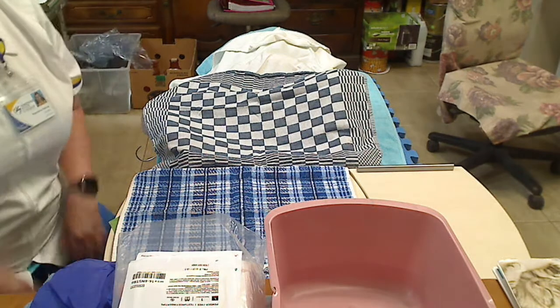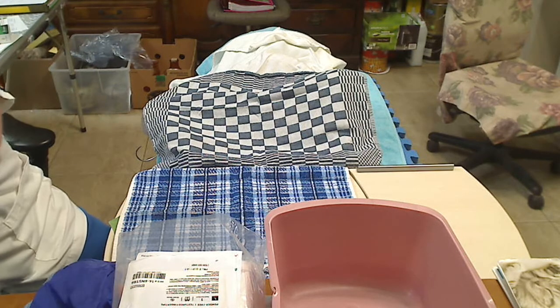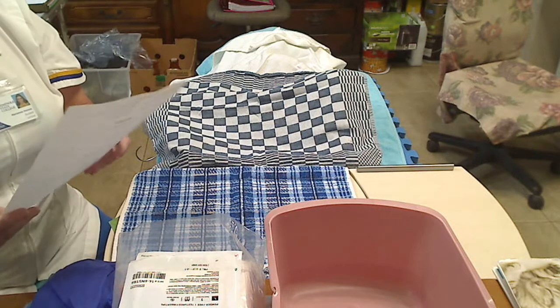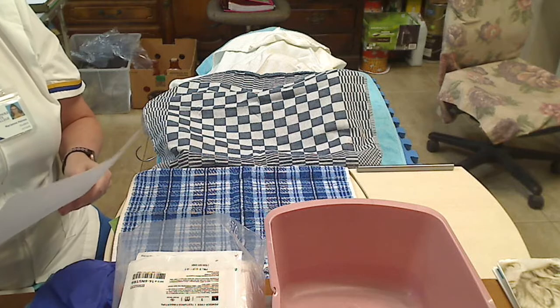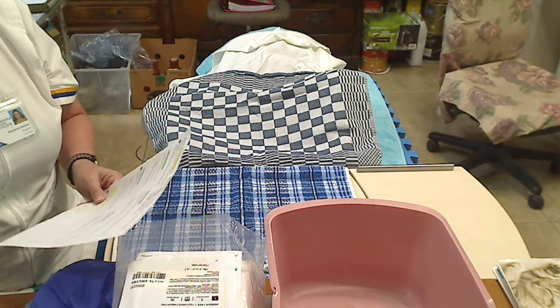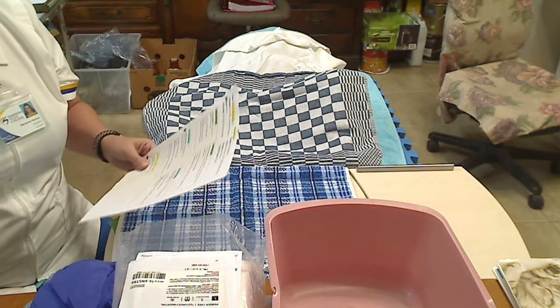First thing I'm going to do is check my EHR, and I'm going to confirm that my patient is due for an indwelling catheter. So Anna Povolowski, so I will go ahead and go into the med room and acquire all of my supplies before going into her room.